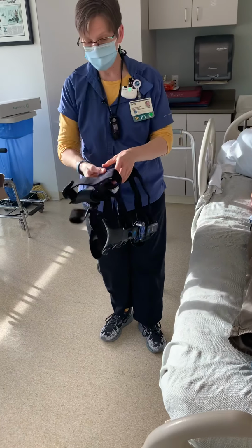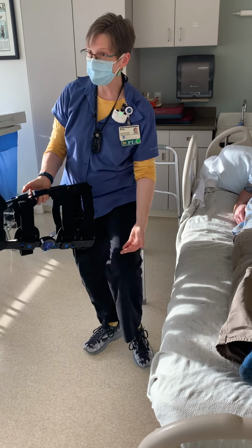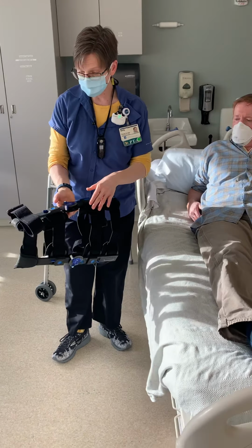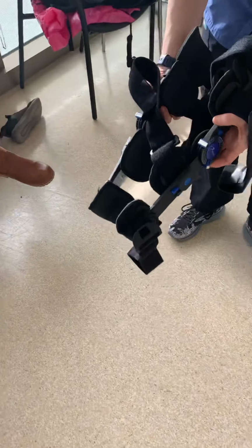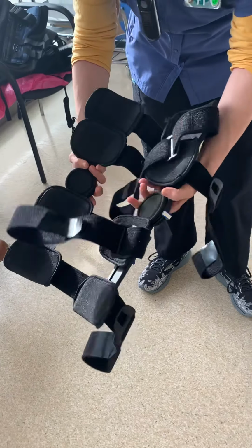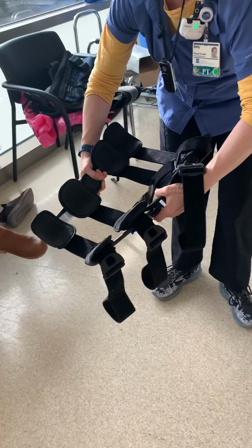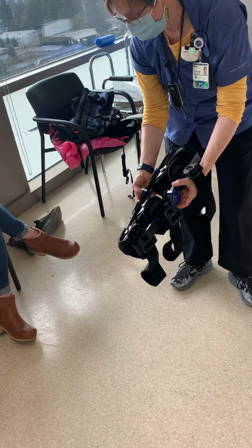Sometimes we would see braces like this for, say, Dr. Khan's tib plateau fractures or distal femur fractures. So it's nice to know how to adjust these. If you take a look here, when they come in the box, they usually come shrunk down quite a bit like this. I've pulled this out a little bit, so if you have somebody with a thicker leg, you pull it out a little. You're looking at the same basic principles though.